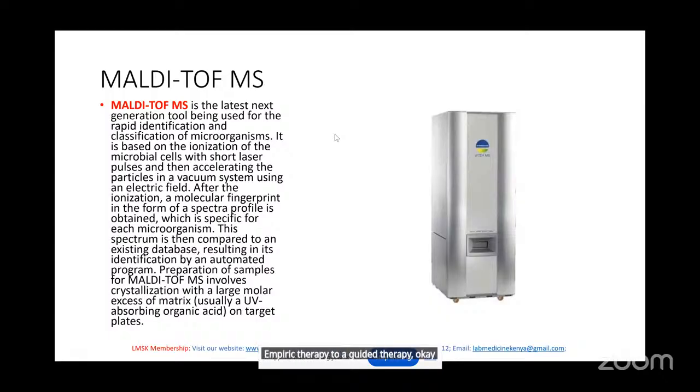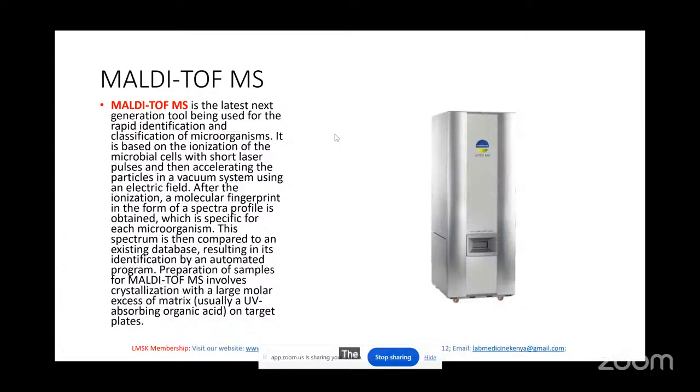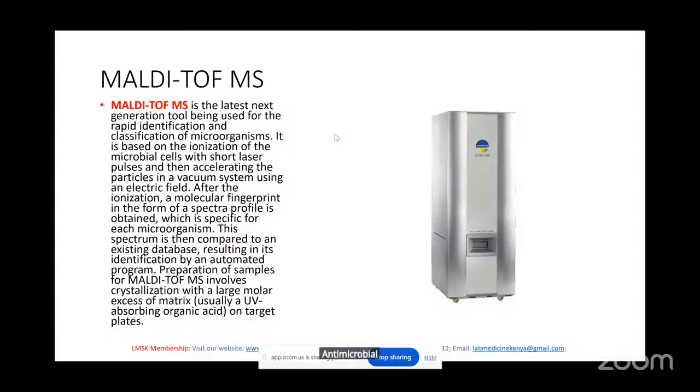Okay, so the faster you can identify an organism and even give a report for this organism, the better a patient is managed. So these are just how these technologies help us reduce that time frame, and this is very important, especially for antimicrobial resistance. Okay.